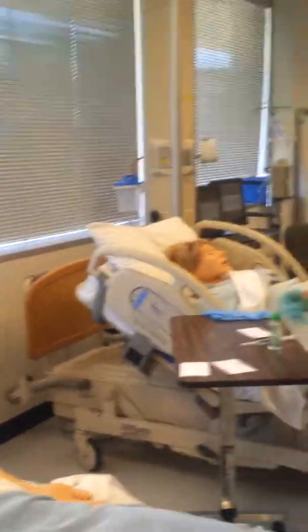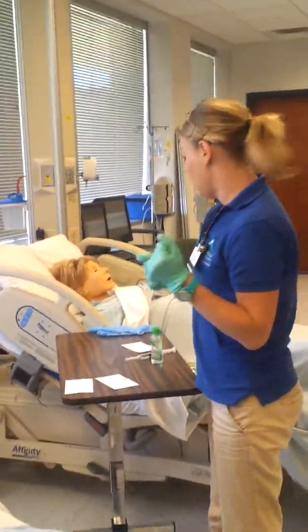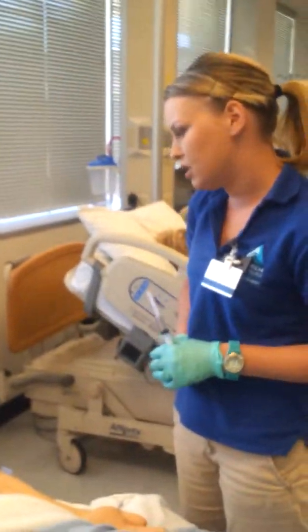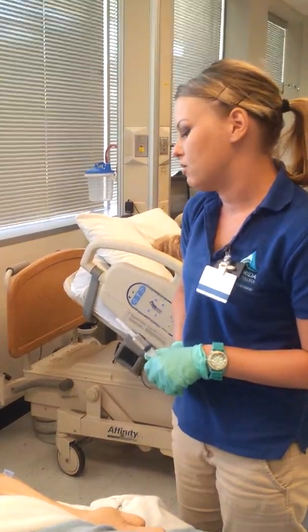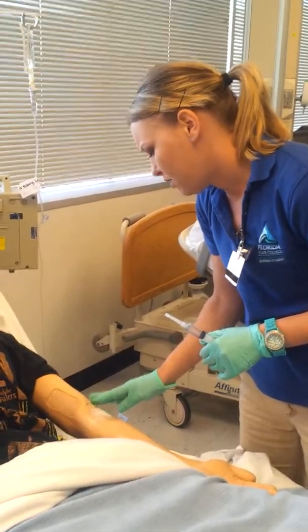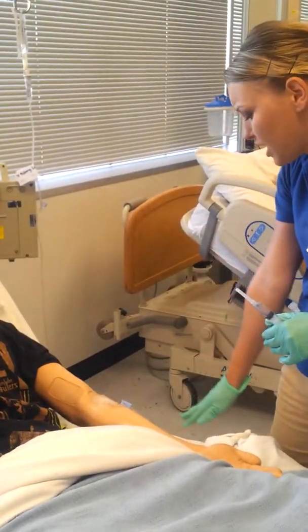Upon coming back into the room, I would perform hand hygiene and replace my gloves. Then I would come in and say: okay, Mr. Johnson, it looks like your medication is finished. How did you tolerate that medication? Do you think you did okay with it? Okay, that's great. I don't see any signs of any red man syndrome. The IV site looks good — there's no swelling, redness, no paleness or coolness, and it's not infiltrated.